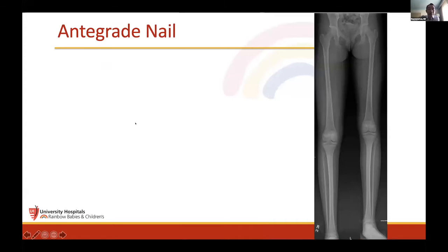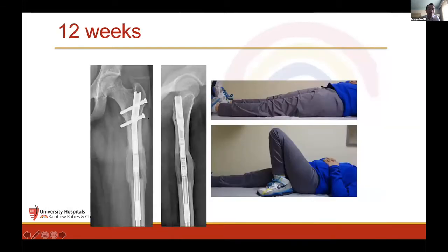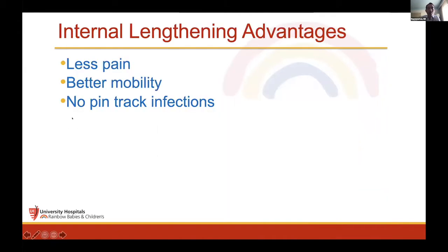If it's an antegrade nail, it's usually a little bit easier. They don't get as much irritation at their knee. And so these go quite easily. It's been surprising how good their motion is. This kid at 12 weeks had that kind of motion actively. And that's just not something I've ever seen with an external fixator. So these have really changed what we can do in terms of there's a lot less pain, there's better mobility of the joints, and we don't have to deal with pin tract infection. So this has really changed the field of limb lengthening, but we always have to remember about the joints.